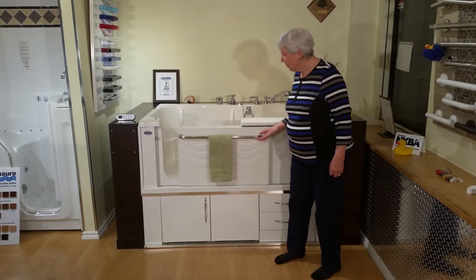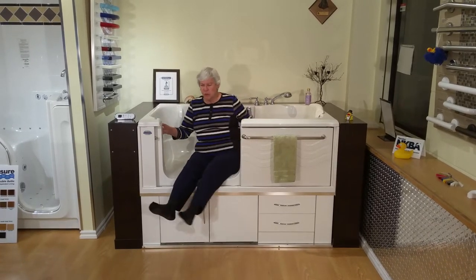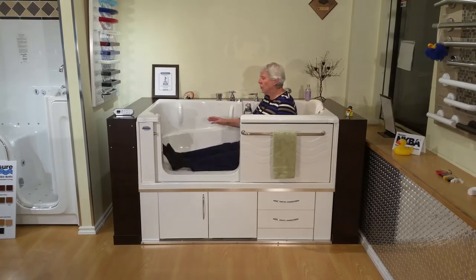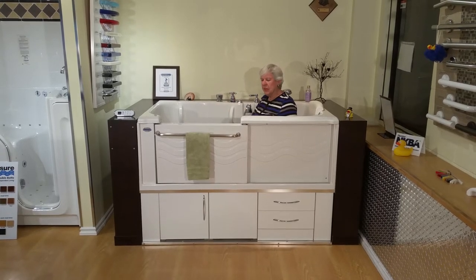To get in, you just lift the handle, slide the door open, sit on the edge, and scoot yourself in. You can use the handholds that are in it, or just put yourself back as I can. Close, lift up on the handle, and you'll hear it click into place.